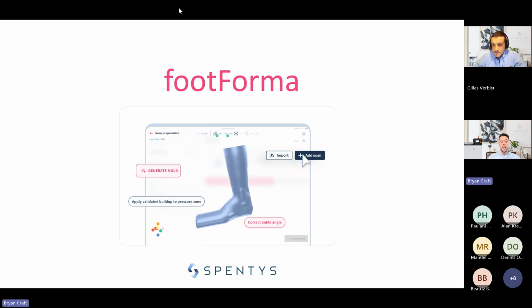Amazing. So if you're joining this webinar, you're most keen and interested in understanding how to modify lower extremity scans with tools and technology that are built for you. Historically, there have been digital workflows that clinicians and technicians have used that are really outside of the O&P industry that have been repurposed for the roles that we have here on the day-to-day jobs of clinicians and technicians. And finally, today you'll see software that is specifically designed for you, from where you could go from a scan of a cast or a limb to a modified mold in minutes.